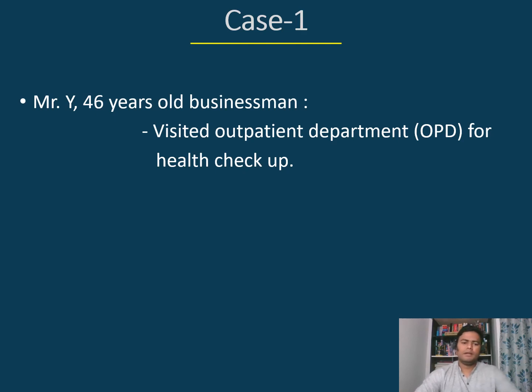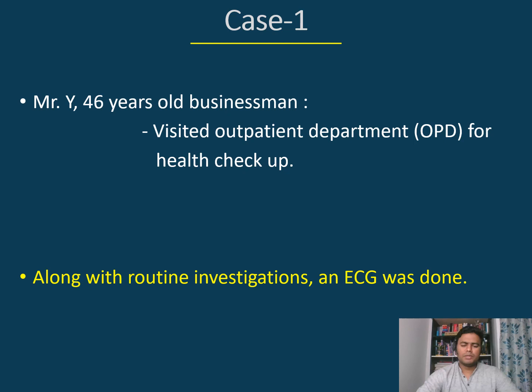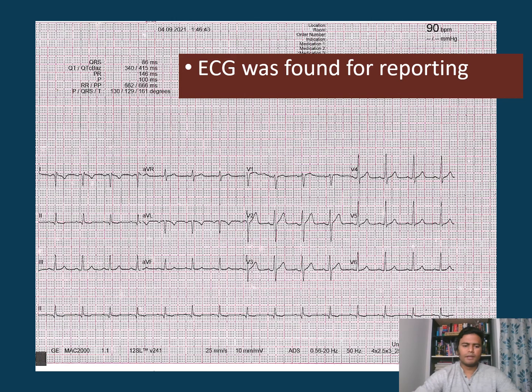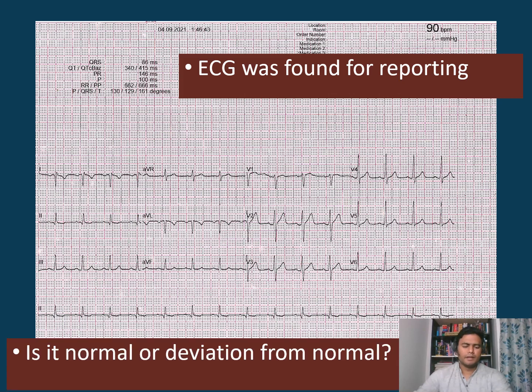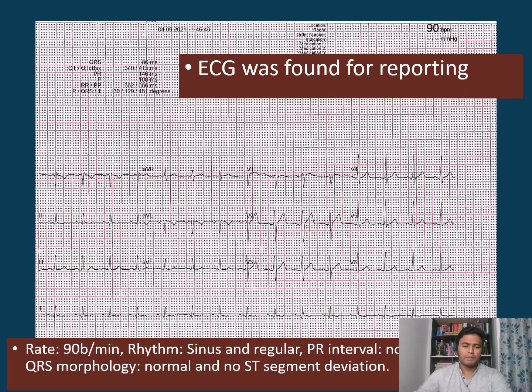Case number one: Mr. Y, a 46-year-old businessman, visited our outpatient department for a health checkup. Along with routine investigations, an ECG was done. This ECG was found for reporting — is it normal or is it a deviation from normal? Let's see.